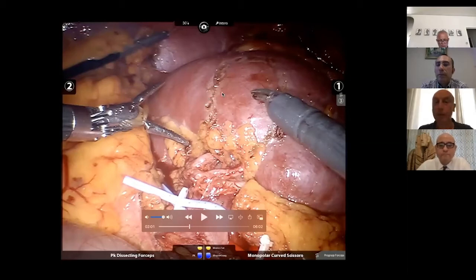So the superimposed imaging is performed manually. It is not automatic, but now we are working to create a new software that is automatic, and we are doing this for radical prostatectomy, where we started with the first experience, and also for partial nephrectomy. In this case, we need some landmarks. The software needs to recognize the landmarks, and so it can automatically overlap the images. This is what we do now. At this moment, we are doing only the manual overlapping.